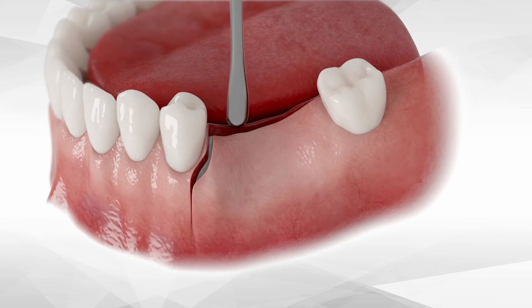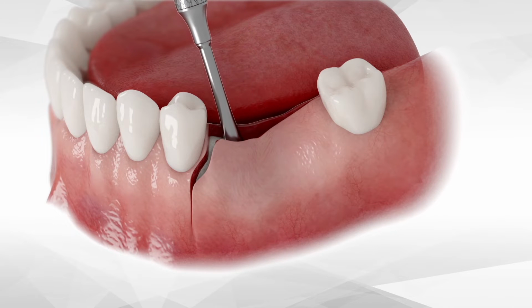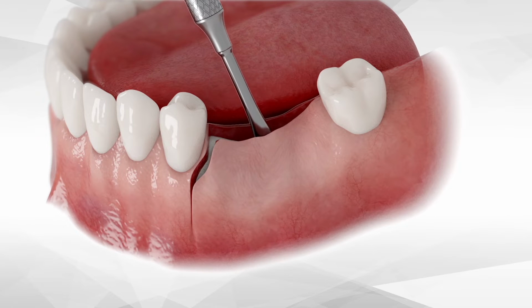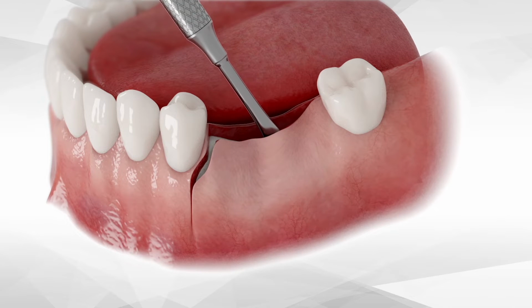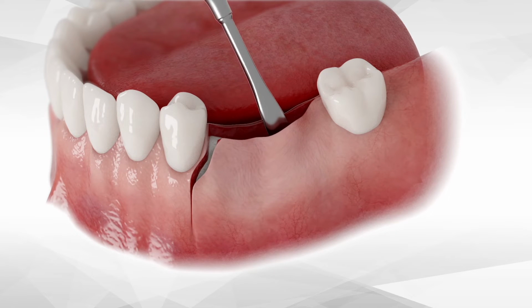Elevate a full thickness flap, but do not exceed by more than 3 millimeters the reflection into the mobile mucosa. However, in the area of the defect, expose as much as needed in order to see the entire defect and then go back to 3 millimeters. Note here that the entire defect has to be visualized prior to augmenting.